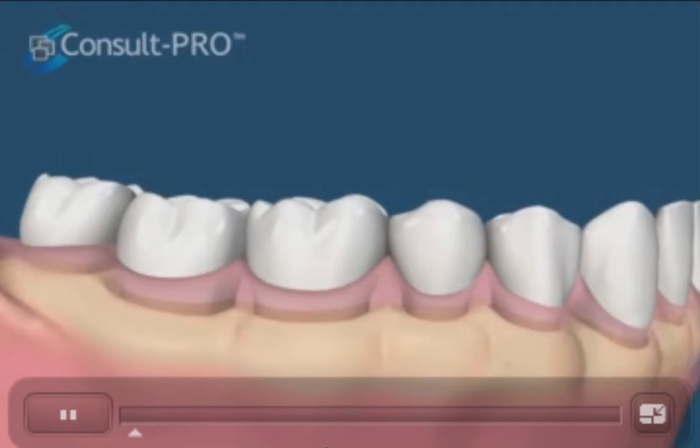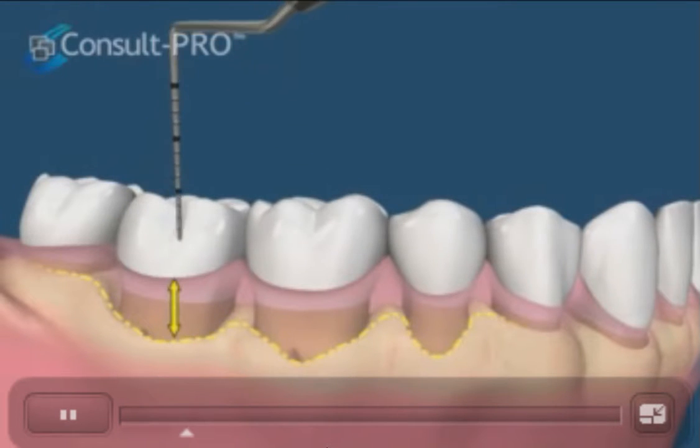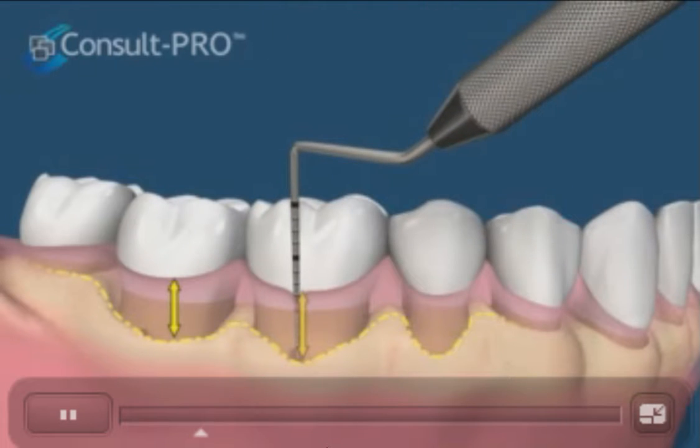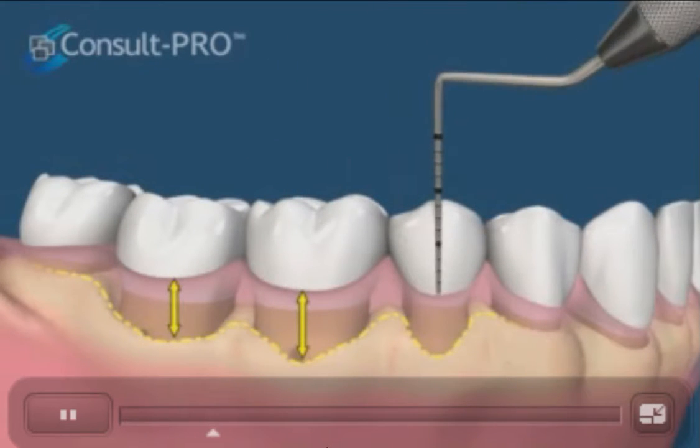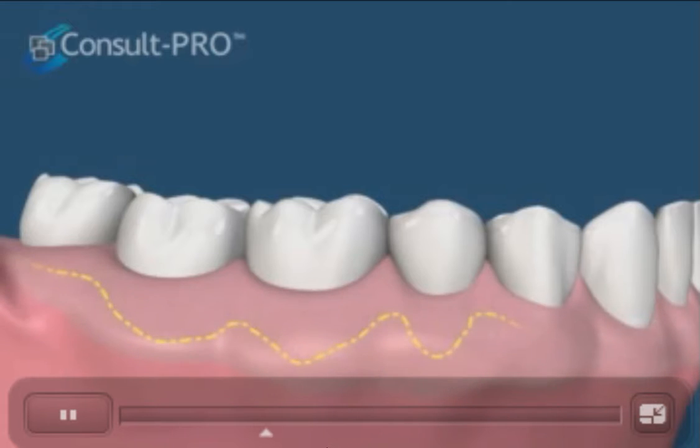This movie shows one procedure that can reduce the pocket depths around teeth. We see here that the bone level is lower than normal, but the gums have not moved accordingly. We often diagnose this by measuring the pockets with a periodontal probe. Pocketing over 4 millimeters will be difficult to keep clean and could lead to further bone loss and increased pocket formation.